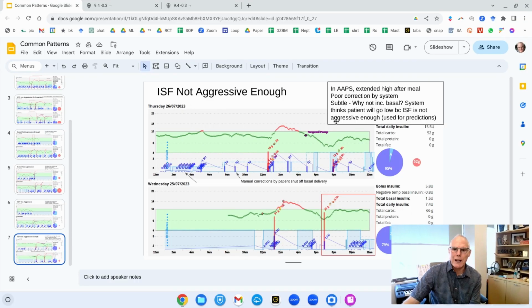So this is in fact the treatment of choice. So if the ISF is 1 to 3, we're going to drop it down to 1 to 2.5 or something like that. So that's the end of my talk. It's very exciting for me. I've been a diabetologist 31 years. Everything seems to be just so amazing now.